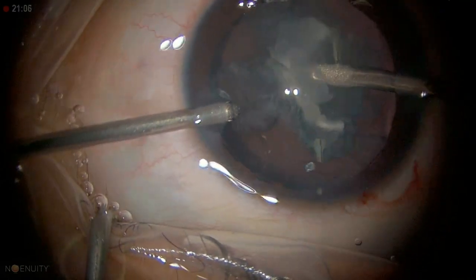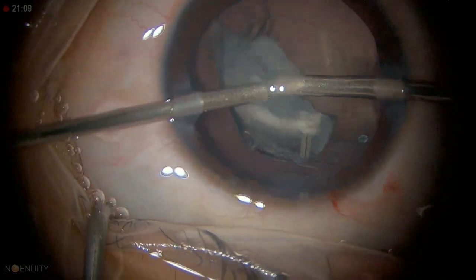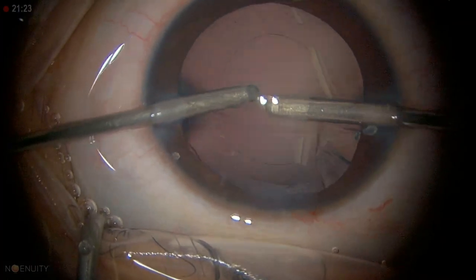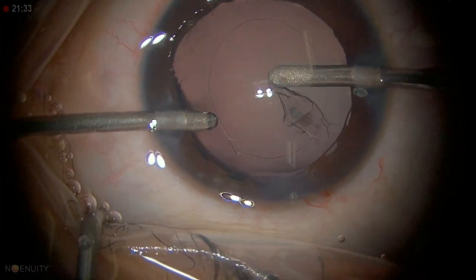We have removed most of it. I am trying to go ahead and do the lens aspiration. Don't be surprised — we might have some more of this material coming.